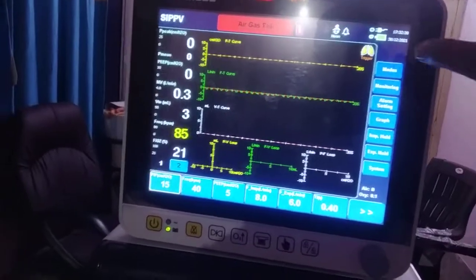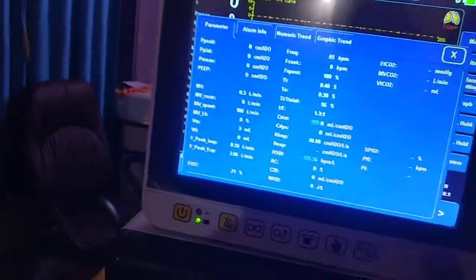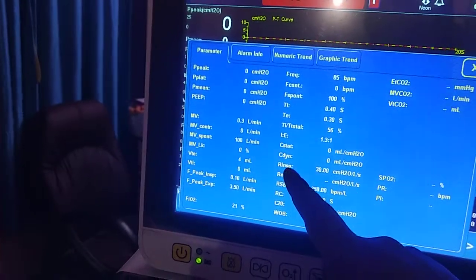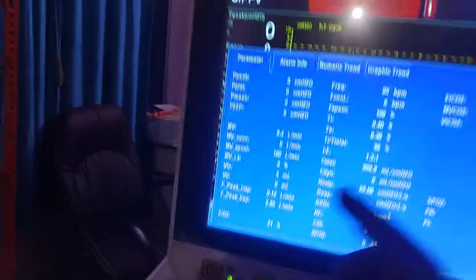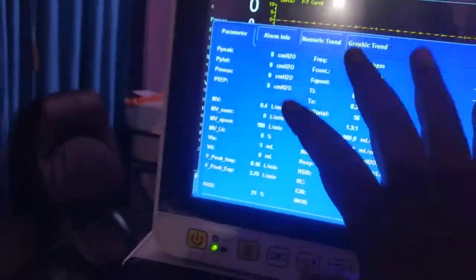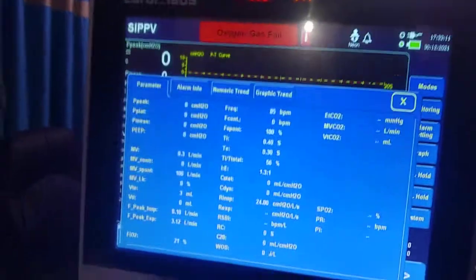If you want further monitoring, you can go to the monitoring section where you'll find many parameters: static and dynamic compliance, inspiratory resistance, RC-XP (an indicator of lung condition), RSBI (an indicator of weaning readiness), Work of Breathing, and MVspontaneous. We will discuss the use of these parameters and how to calculate them in a later video.